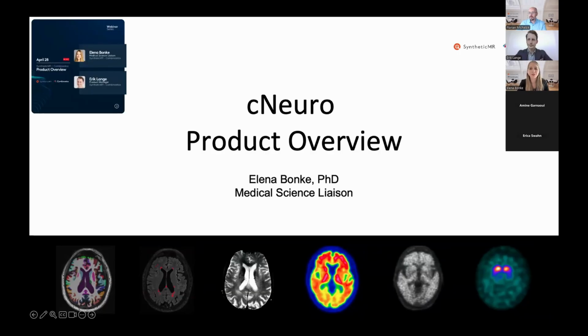So it's my pleasure to give a product overview of our cNeuro product today. And also for those of you who already know our solution, maybe we have some already existing users joining, I'm sure I will have something new for you as well to show.